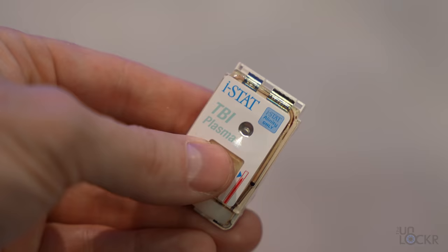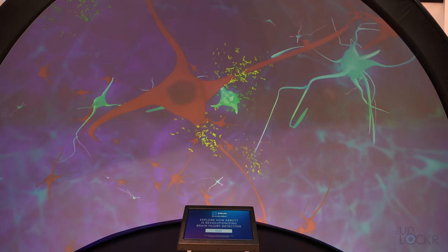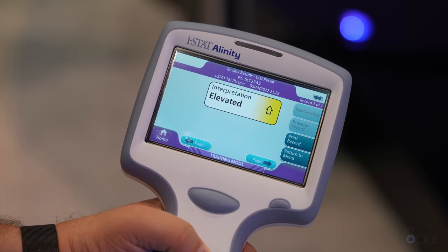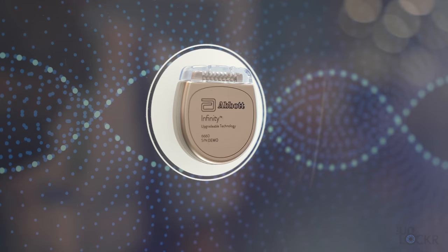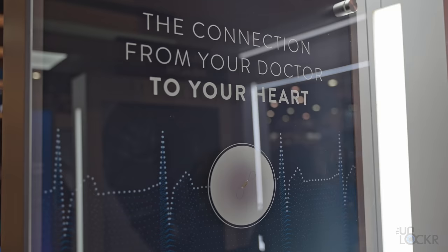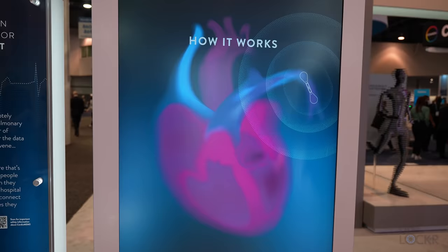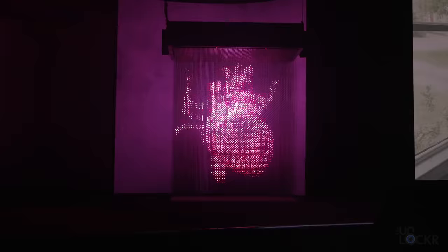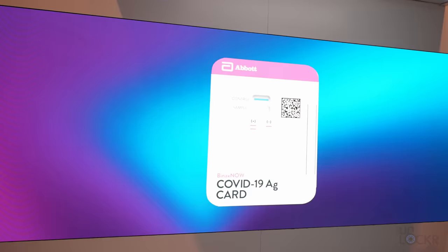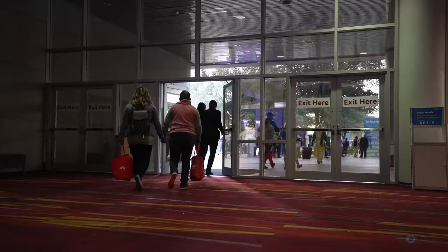While we're here at the Abbott booth, it turns out that Abbott makes a lot more than just COVID tests. This is the iStat TBI plasma test, the world's first rapid test to detect proteins in the blood released by the brain after a concussion, to give objective detection right after someone comes off the field. And this is the Infinity DBS system that can send electrical impulses to the brain to stop tremors for people with Parkinson's disease, and can even be remotely adjusted by a physician. And then there's the CardioMEMS device, the size of a paper clip, that can be implanted in the pulmonary artery to detect pressure changes and remotely monitor heart failure, automatically uploading data to your physician. Okay, let's head outside and talk more about the tech in the at-home COVID tests.